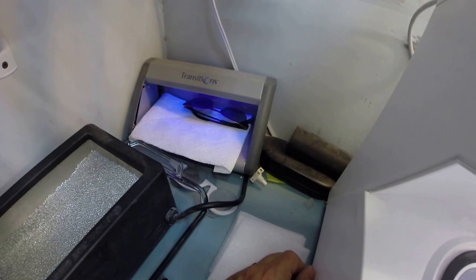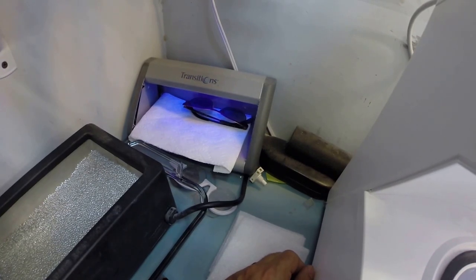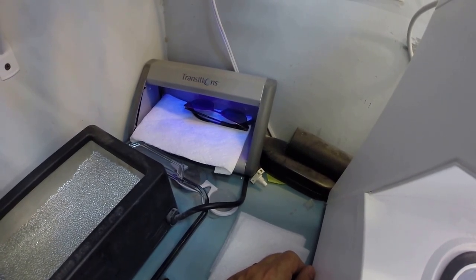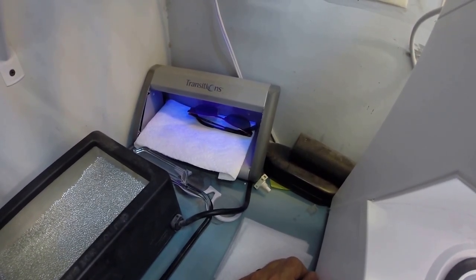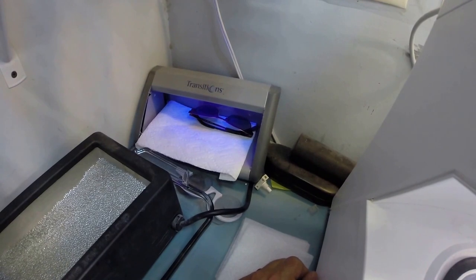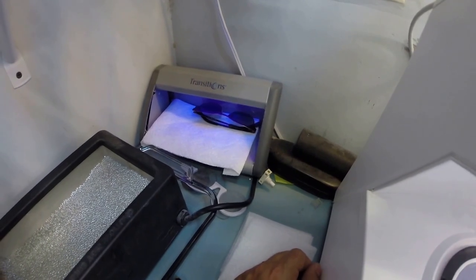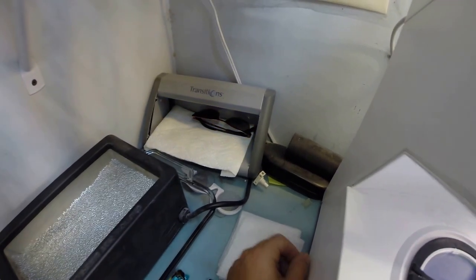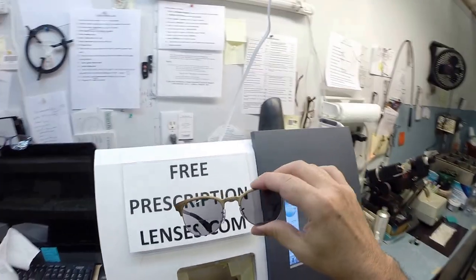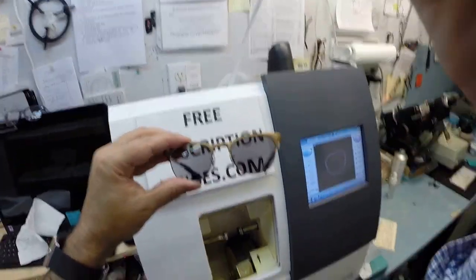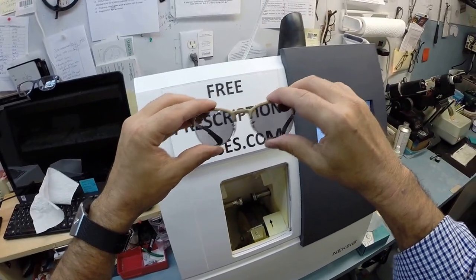This is also important. They're temperature sensitive, meaning they will darken when it's 85 degrees and below better than they will when it's 95 and above. But I remind everyone, when it's 100 degrees outside, you're miserable, they're miserable. Nobody works 100% when it's 100 degrees outside. But being in Colorado, with the cooler weather you have, they'll get very, very dark. Now, this is the first time they have been activated. Don't worry, Mark. They're going to get much darker than this. Come on, Mark. Don't you remember we talked about this?